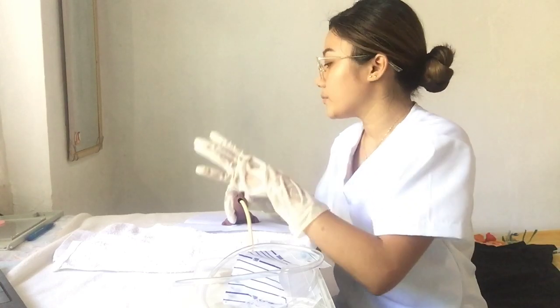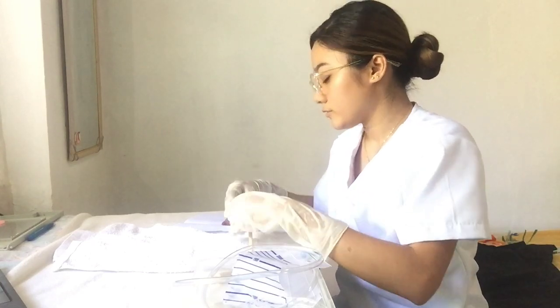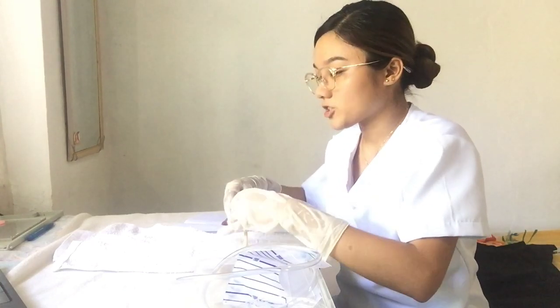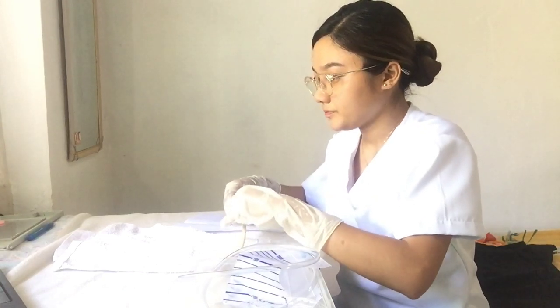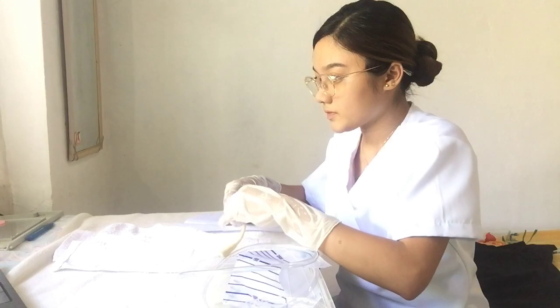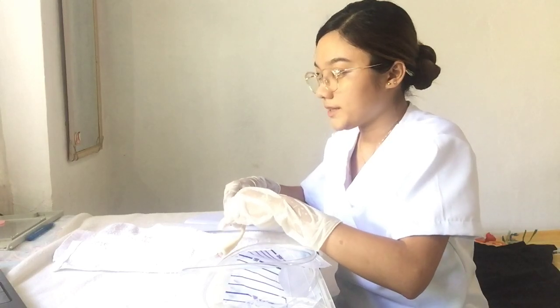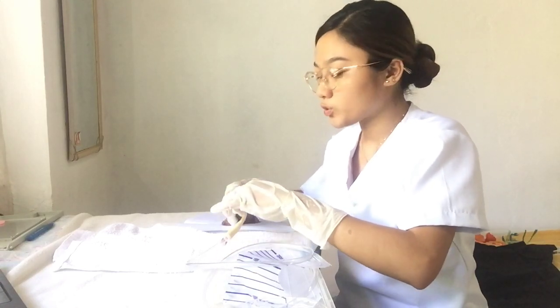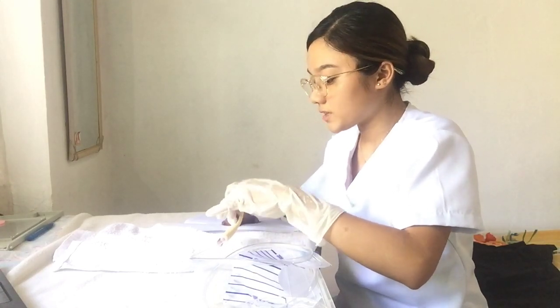Ask the client to take a deep breath to promote relaxation. Then insert the catheter an additional 1 inch or 2.5 centimeters.